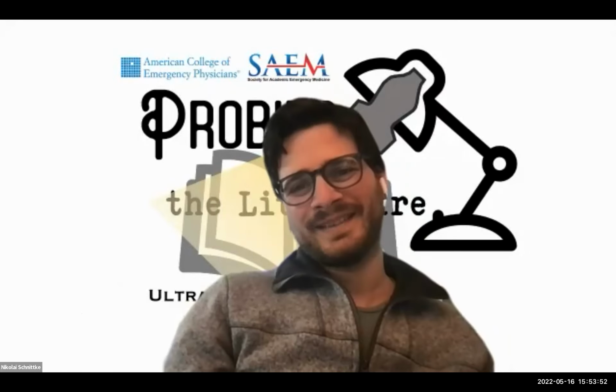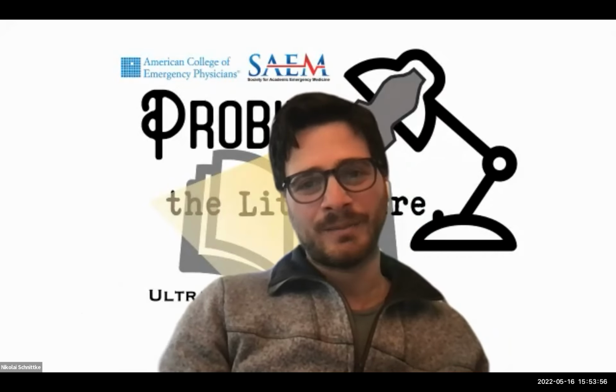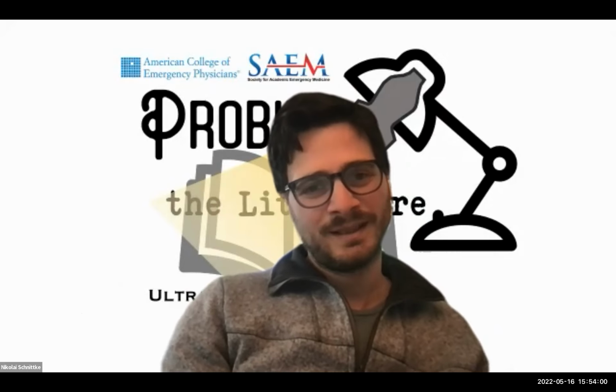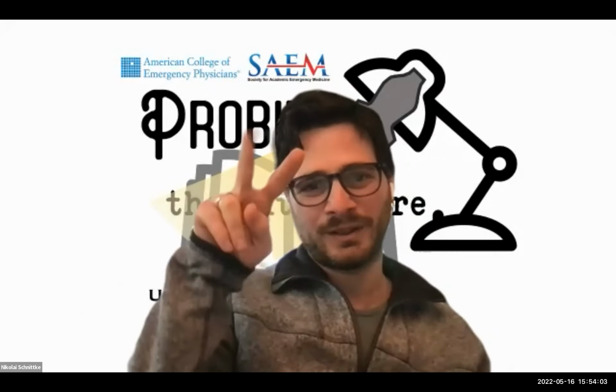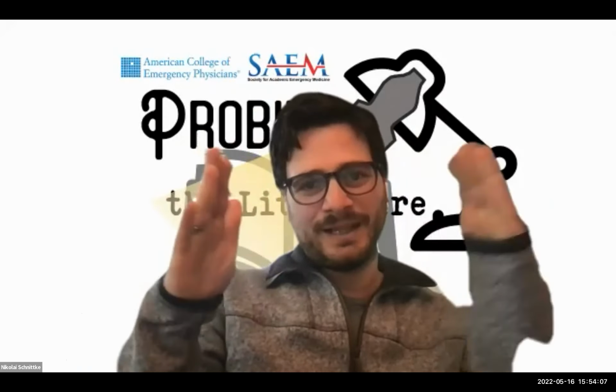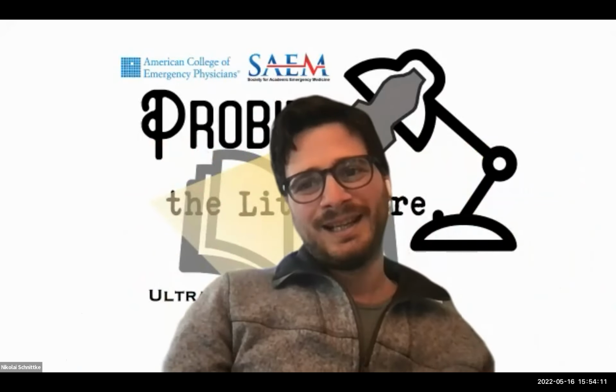Today we focused a lot on technique and cutoff, and how they don't describe the technique that they used. Even in our group of experts, there was disagreement about whether the shadow on the sides is an edge artifact or encompasses the subarachnoid layer, and if you're supposed to measure that.